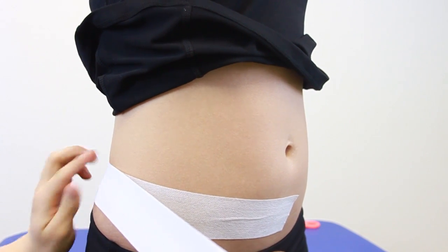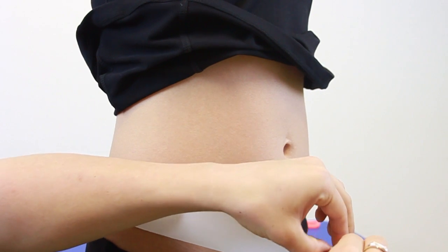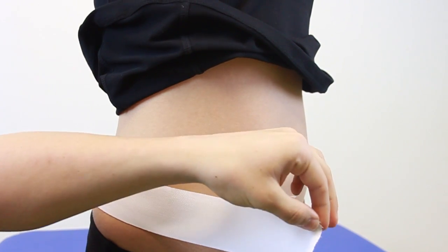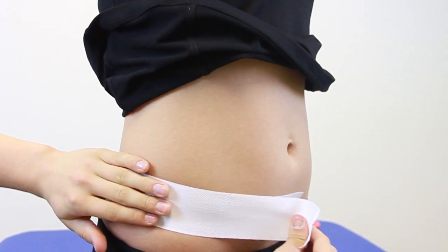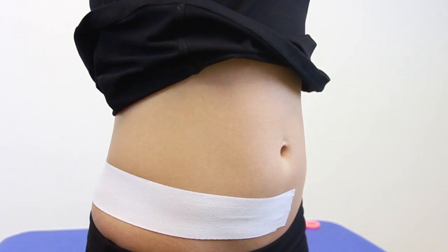We're going to apply the zinc oxide exactly the same way, straight over the top of the fixing tape, applying with a slight stretch again. Make sure we're just above the hip.